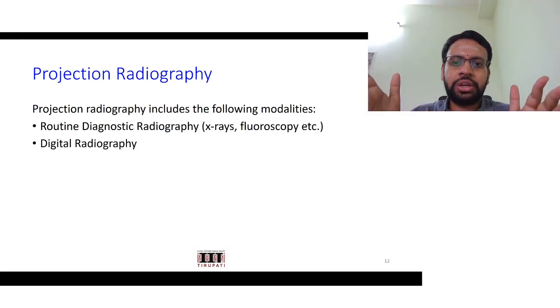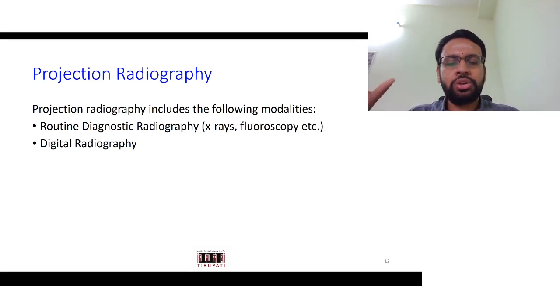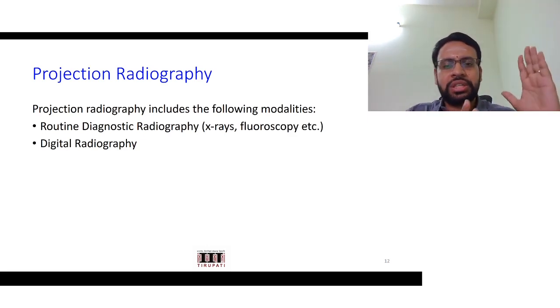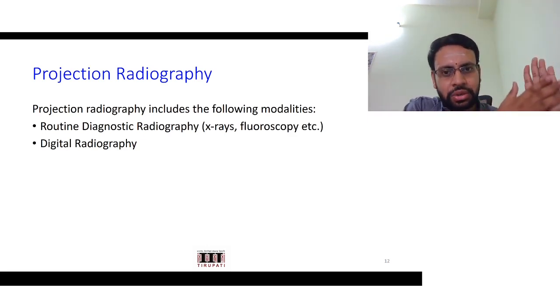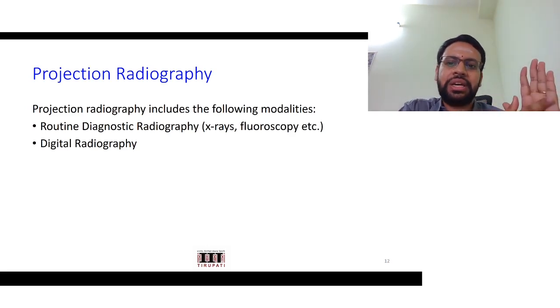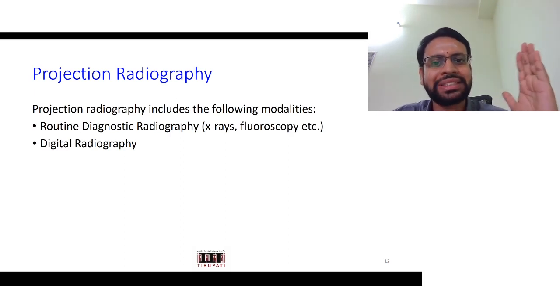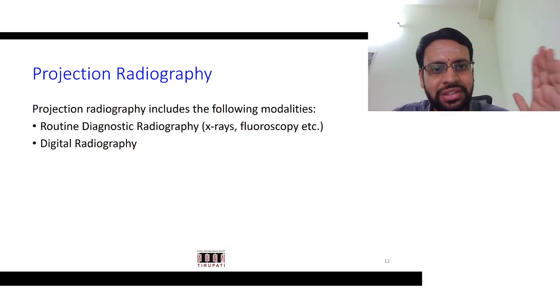As I mentioned, your source is X-ray. Whatever got transmitted through the object and whatever is remaining, based on that you will figure out what the object is. So basically you use X-rays, but the sensor could be either a film or you might record it digitally. Earlier, in the beginning days, you had a film that is sensitive to the strength of the X-rays.